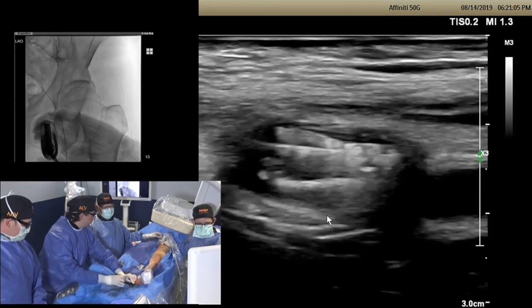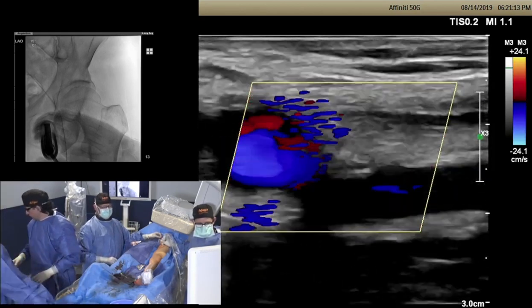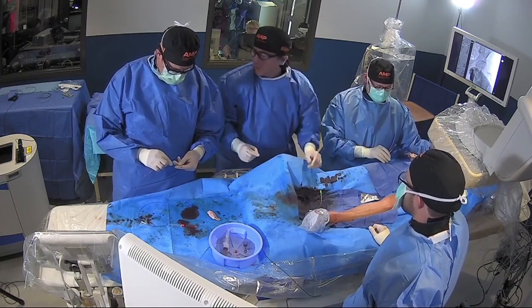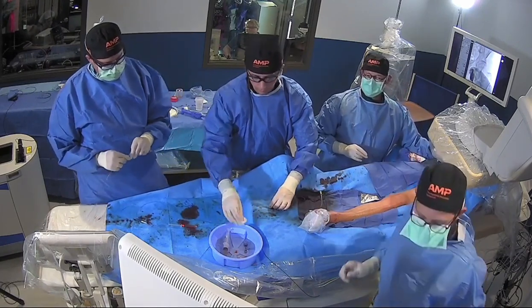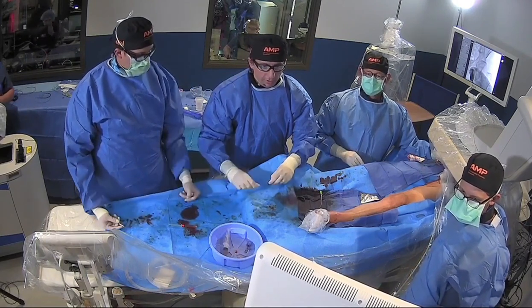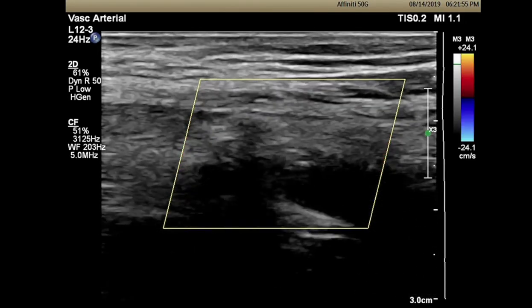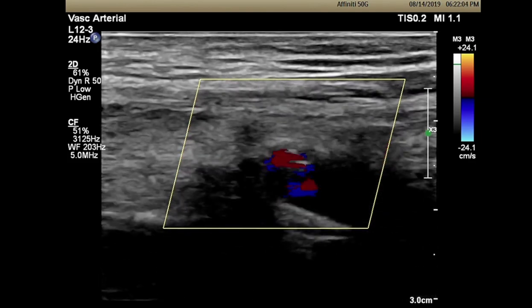Let's have the 5.0 balloon first to treat the stent, then go with the Stellar X balloon. Dr. Walker, would you post-dilate with a 5.0 or 6.0? Probably use the 6.0. Do we have a Stellar X 120? Ben tells me we actually covered the ostium of the profunda.